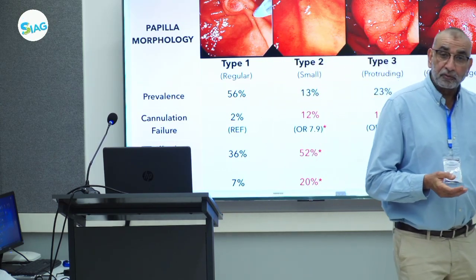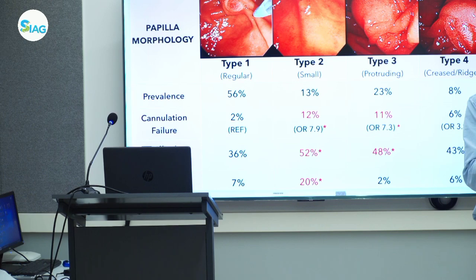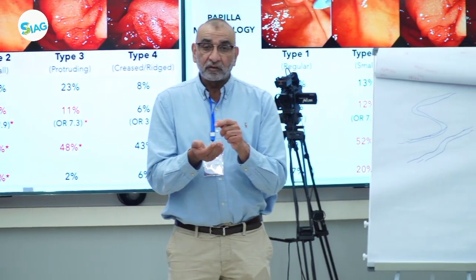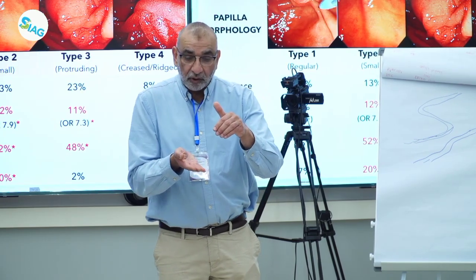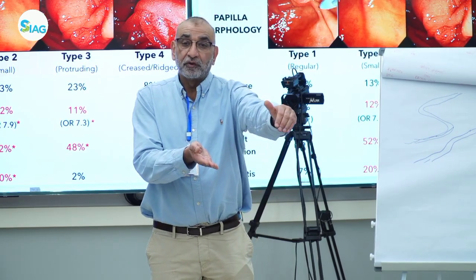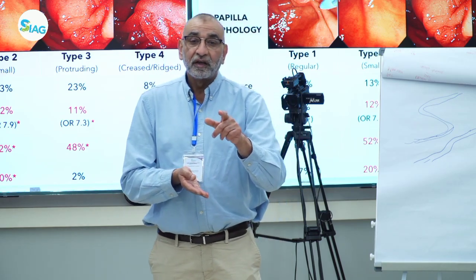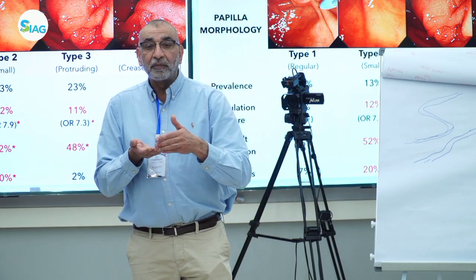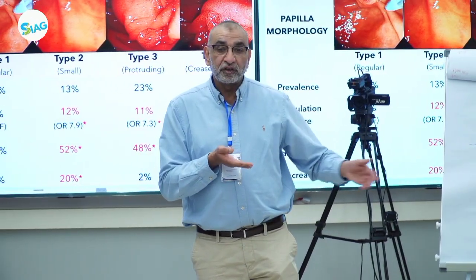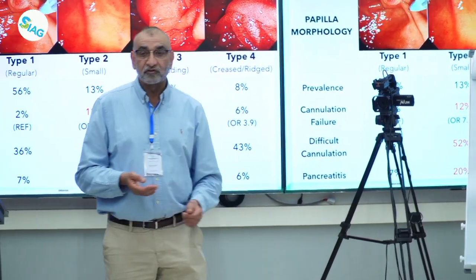अगर आप स्कोप को एडवांस करेंगे तो देखें, जब आप अपने स्कोप को शॉर्टन करते हैं, उसके बाद स्कोप को और पीछे खींचते हैं, that brings the papilla closer to your scope. जब आप स्कोप को एडवांस करते हैं, that takes the papilla away from you. ये बहुत कम ओकेजन है when you have to advance your scope. Normally you always pull your scope back ताकि पेपिला आपके करीब आए. This is one of the few situations where you have to push the scope in, bring it straight.